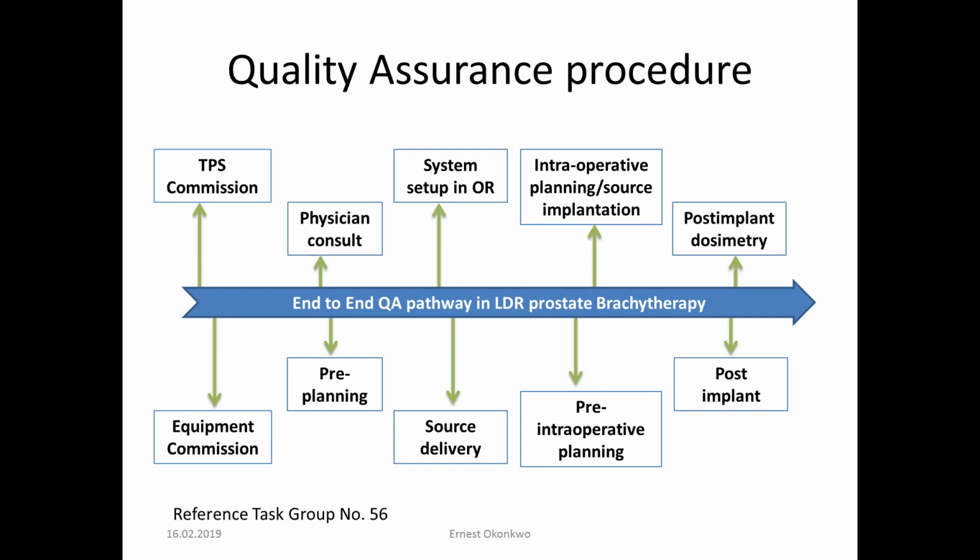For the intraoperative planning and source implantation, you want to make sure that the urologist or the radiation oncologist you are working with places the seeds where you want them to be, so as to have a good coverage of the prostate that you're treating.